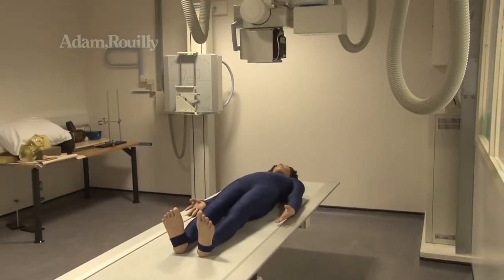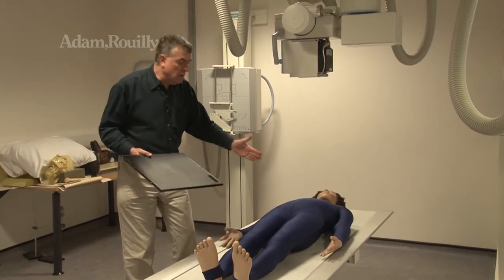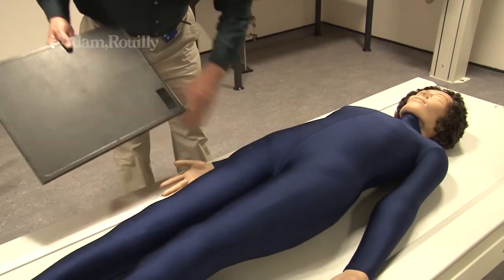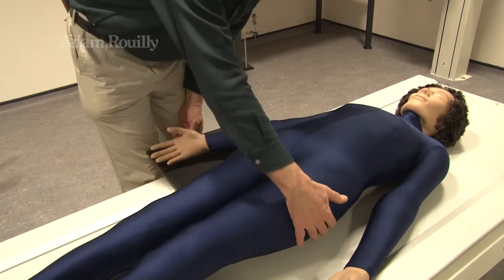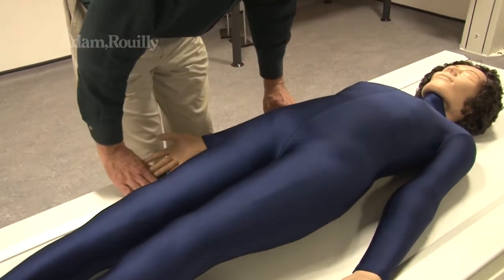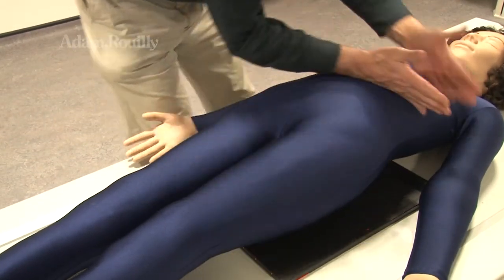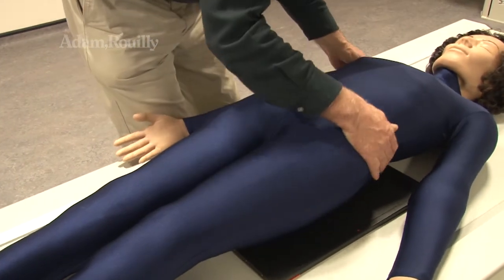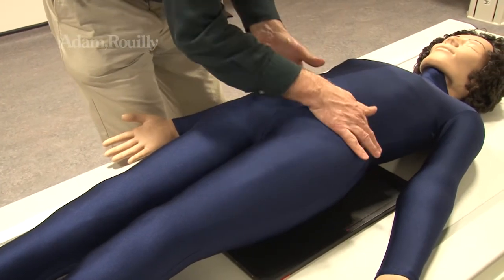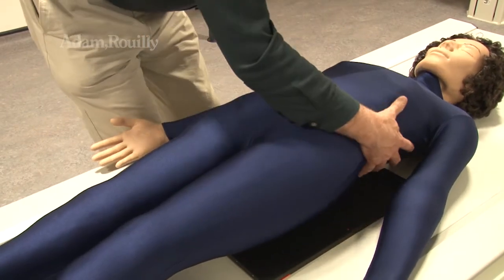Right, now we're going to do the pelvis. But of course, very carefully to make sure that I get overlap with the lower part of the chest. So we're going to do this portrait to include the abdomen and the hip joints. So same procedure again, making sure the patient is straight, not rotated. We don't want it where one hip is higher than the other. That would cause us to have an unsymmetrical image and a hard to gauge quality.